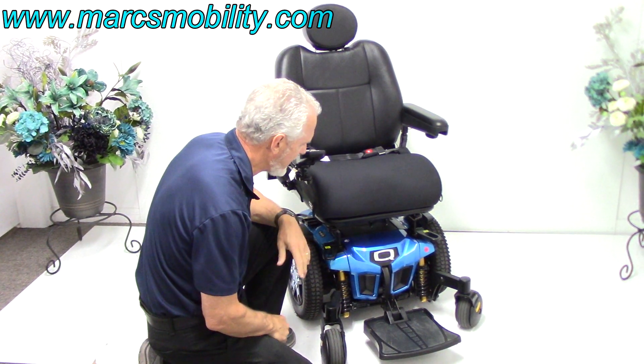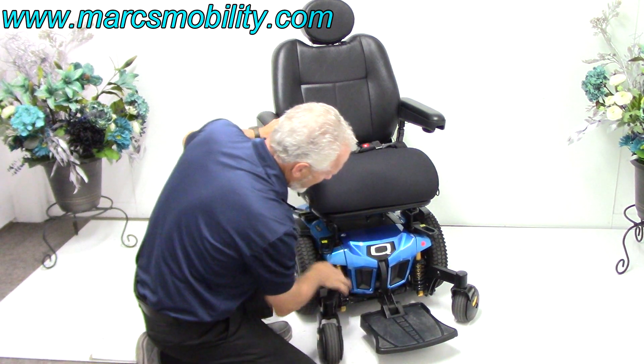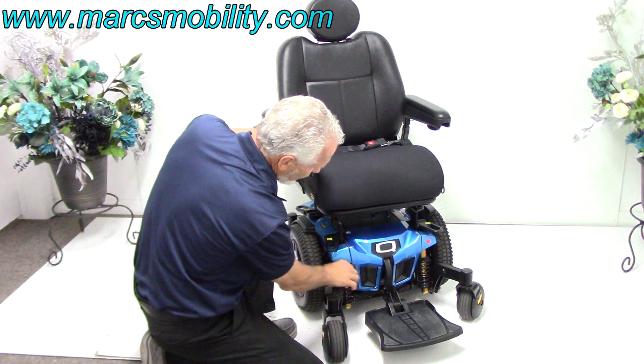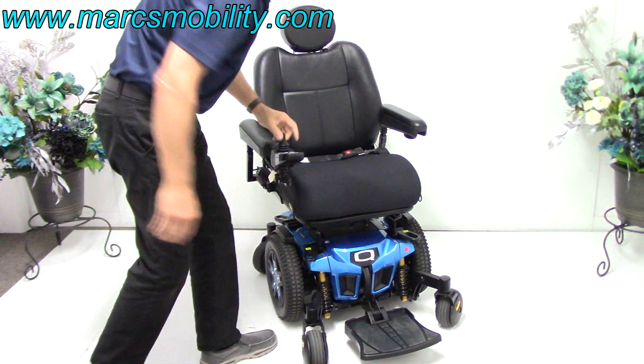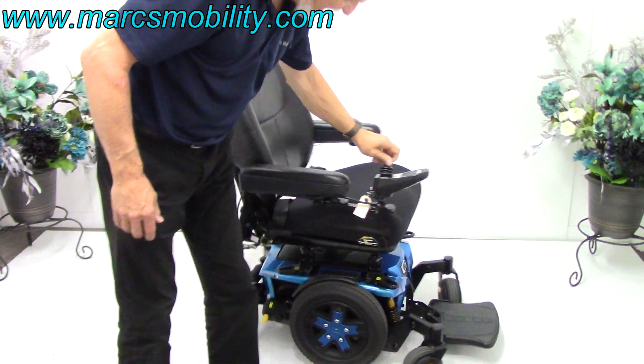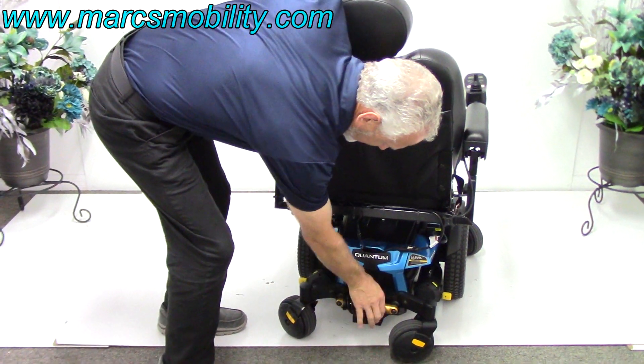You can see the suspension on this chair. The suspension is adjustable by turning the ring — we can tighten up these springs. You have the suspension in front, and you have the same suspension in the back, also adjustable by turning the ring.